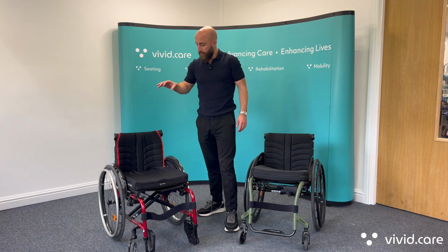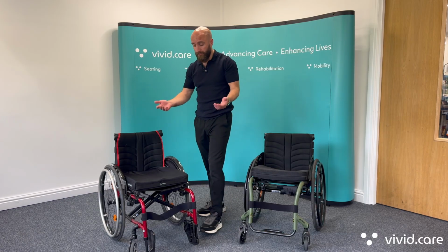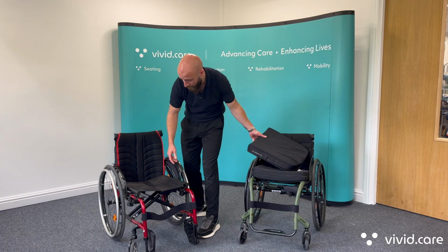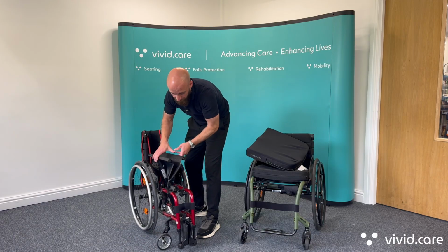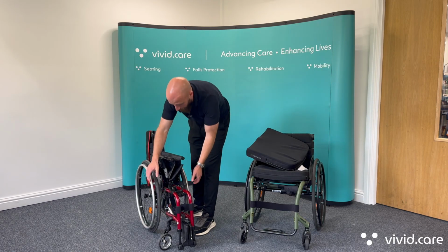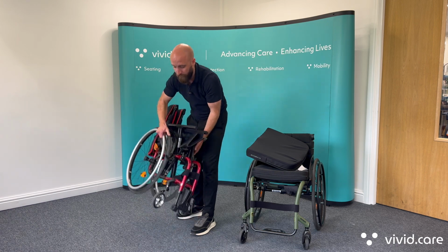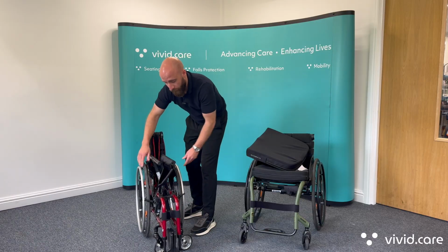And to run over a folding chair now, this is, again, one of our most popular models, the Quickie QS5, and this folds very much as you'd imagine a traditional wheelchair to do. So you take out the cushion, and just by pulling up on the seat canvas, squeeze together. What I really like about this model is there's an extra locking clip here that clips the wheelchair together, so as you go to lift, whether that's from the seat rail or from the wheels, it doesn't open back out on you as you're doing that. So yeah, it works really well.